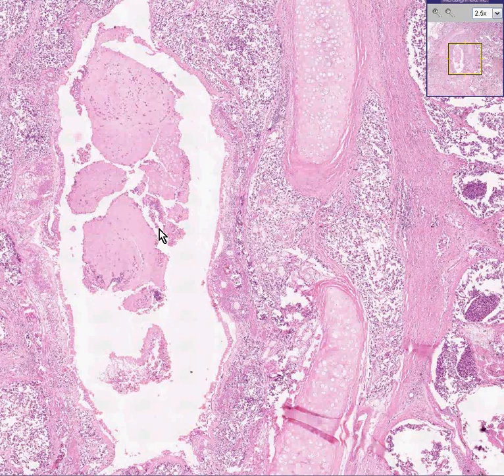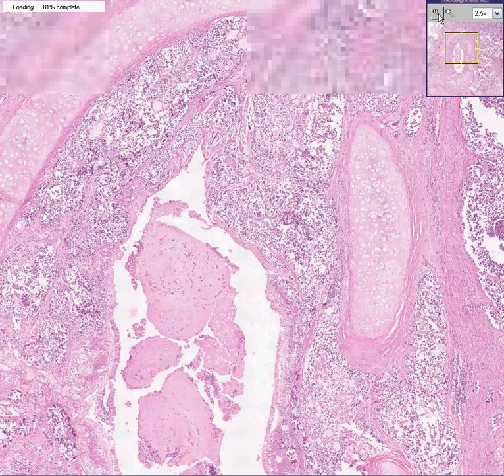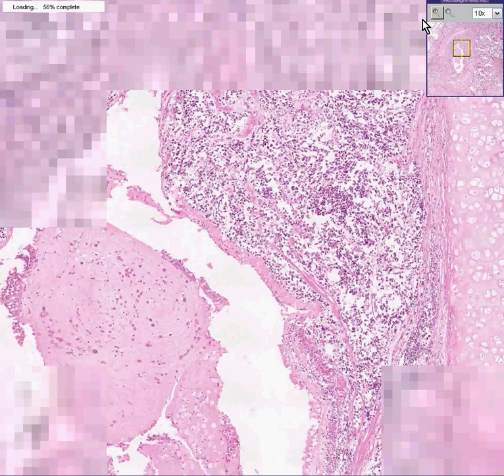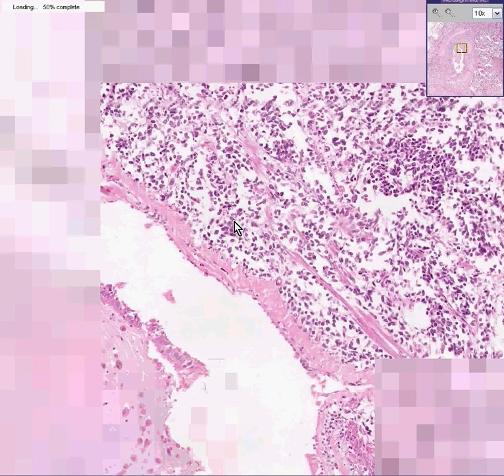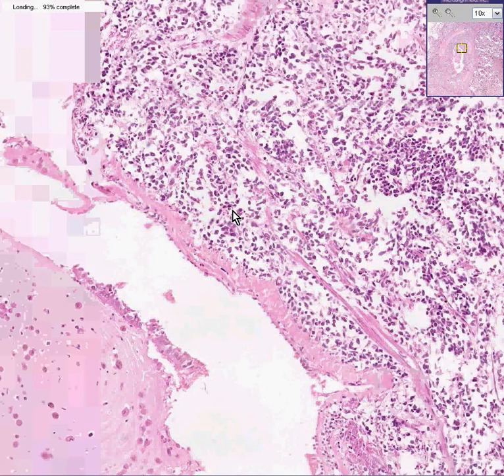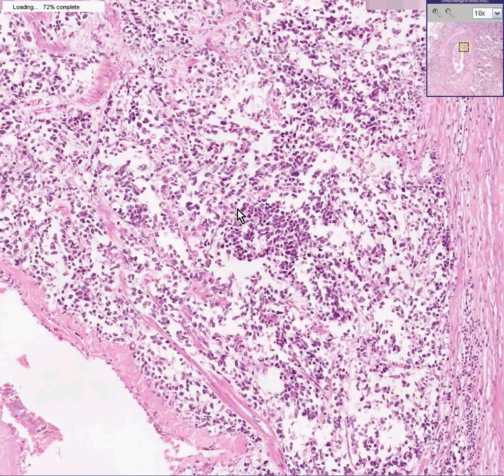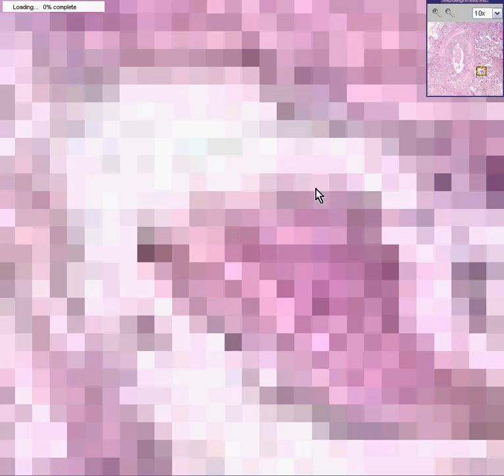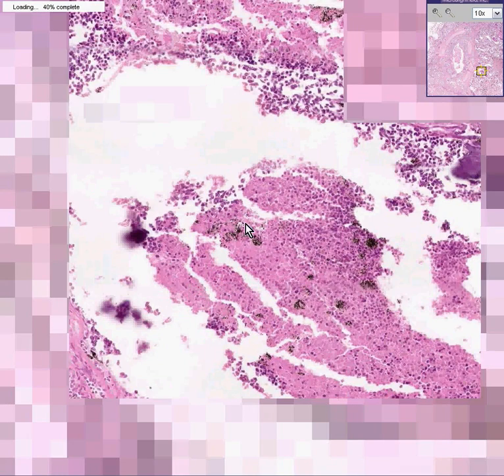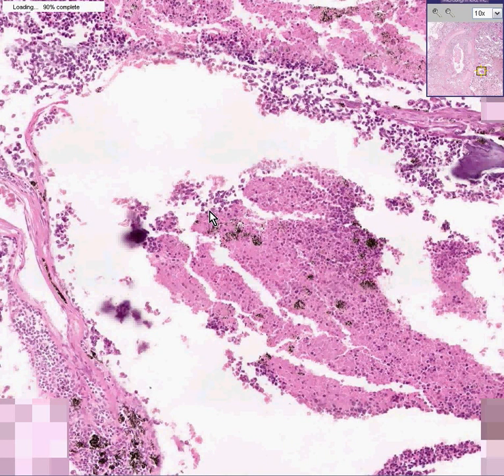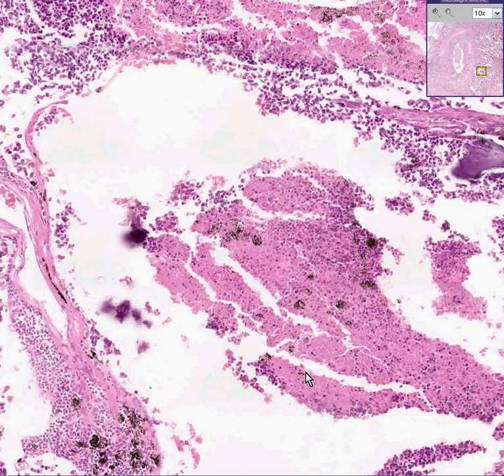Let's look at some of these tumor cells. We could see that they are small cells. Most of their body is nucleus — there's very little cytoplasm. Here's an area in which they are clustering around a blood vessel, so you know it's rapidly growing. And here's another area, slightly away from the bronchus, in which there's extensive necrosis. In some areas you could make out residual viable tumor cells, but in this area the whole tumor is necrotic.